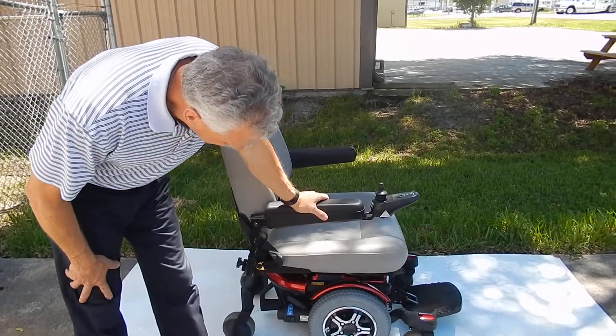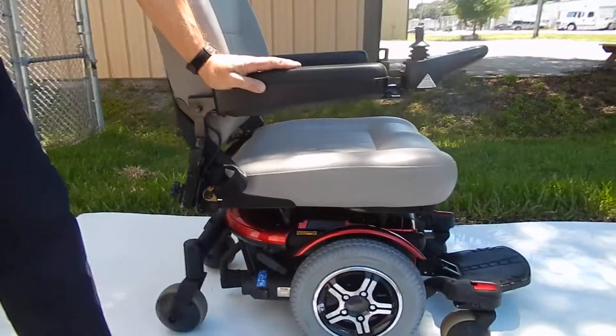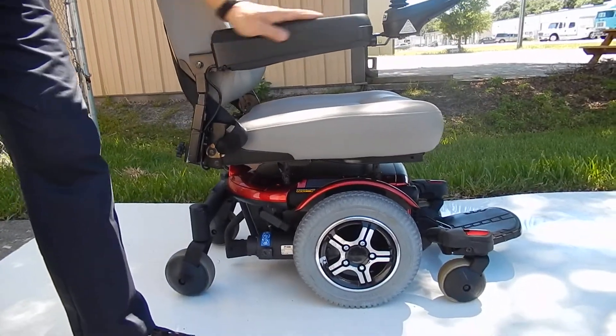This is the Quantum 600 XL. This chair is also made by Pride Mobility. This is one of their upper line.